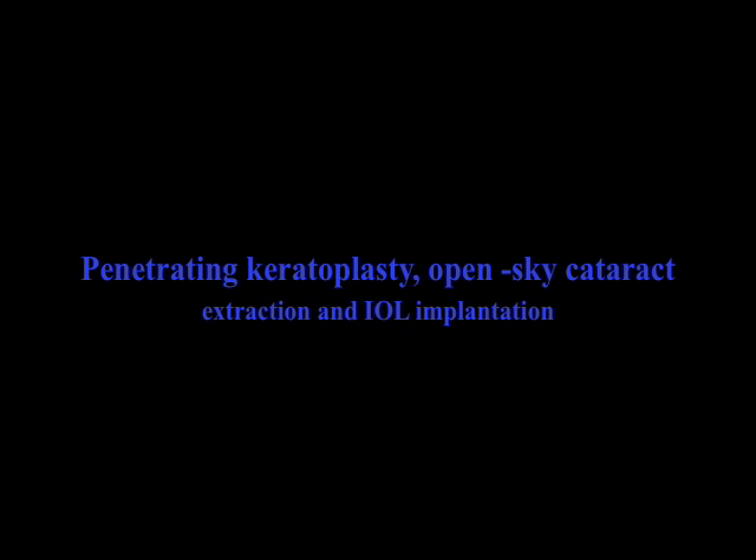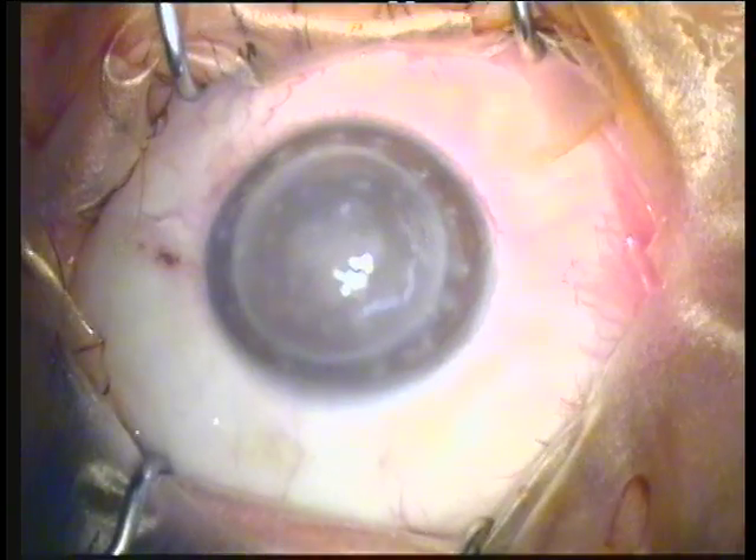Hello, my name is John Kanellopoulos. I'm a cornea transplant surgeon and I'll be sharing with you today the triple procedure: penetrating keratoplasty combined with open-sky cataract extraction and intraocular lens implantation. A fascinating procedure.